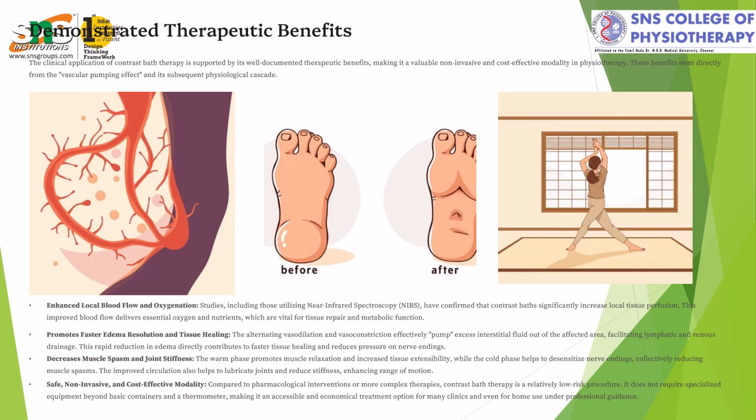Then the therapeutic benefits: before and after, the patients will feel very much relieved, like pain is reduced, and it improves tissue healing. It decreases muscle spasm and joint stiffness. It is a very cost effective modality, and it is very safe and non-invasive. The patient can use this by himself or herself at home. So this is the contrast bath. Thank you.